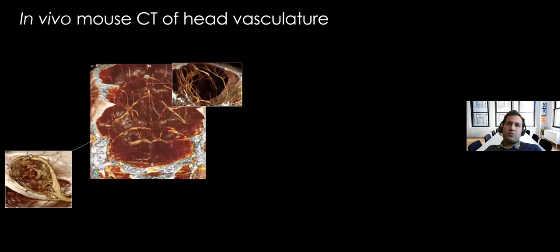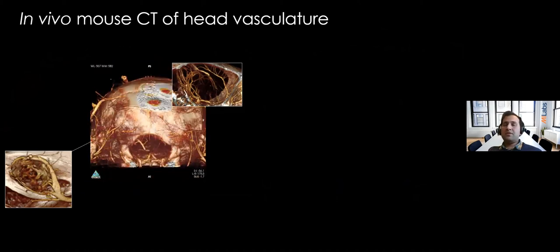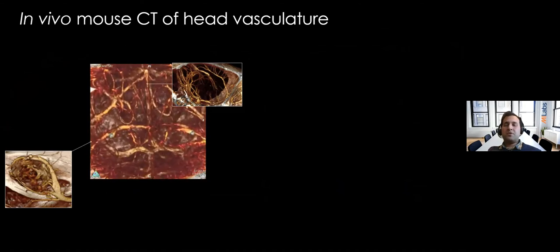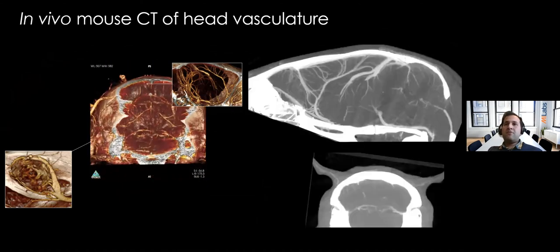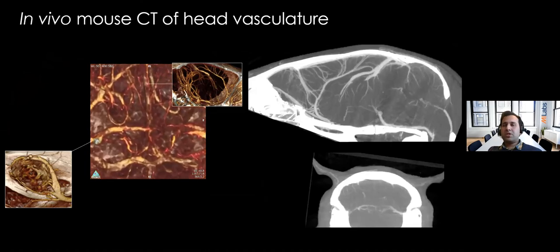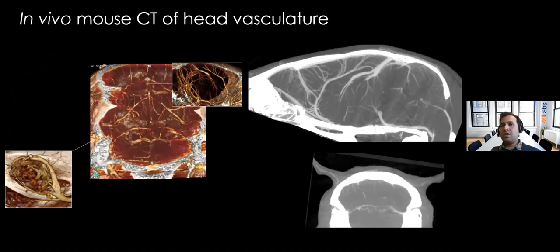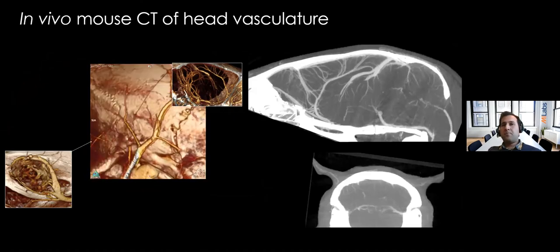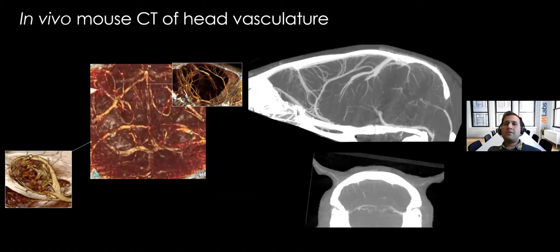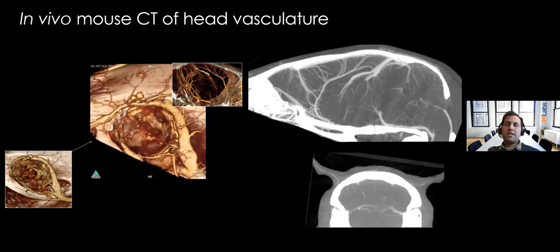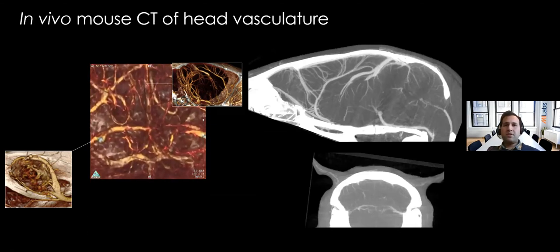We can also do analysis on the brain. When the animal is injected with a contrast agent, we can even see the blood vessels in a mouse brain. We can travel through, check the structures, and create multiple projections put together to allow us to see the angiogram of the brain. We can nicely see tiny little structures here. This allows us to do further quantifications, for instance, vessel diameter analysis or quantifying the abundance of vessels in the brain.